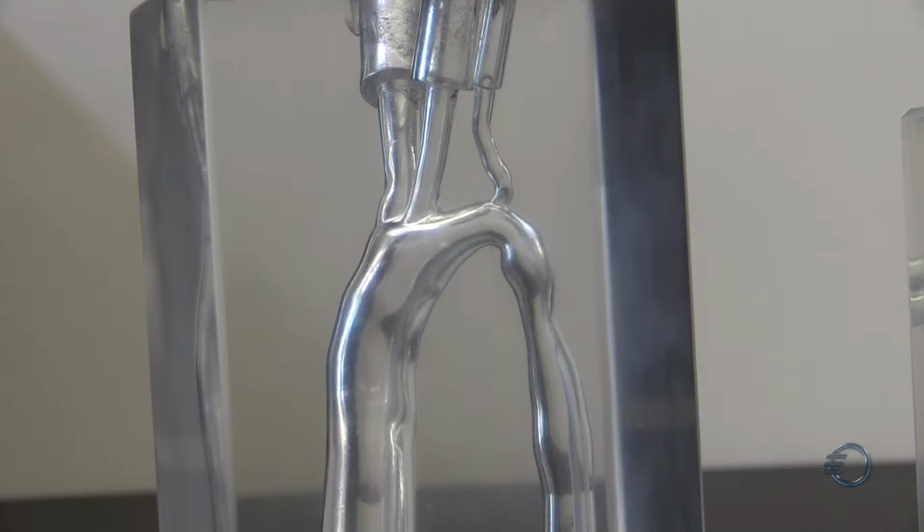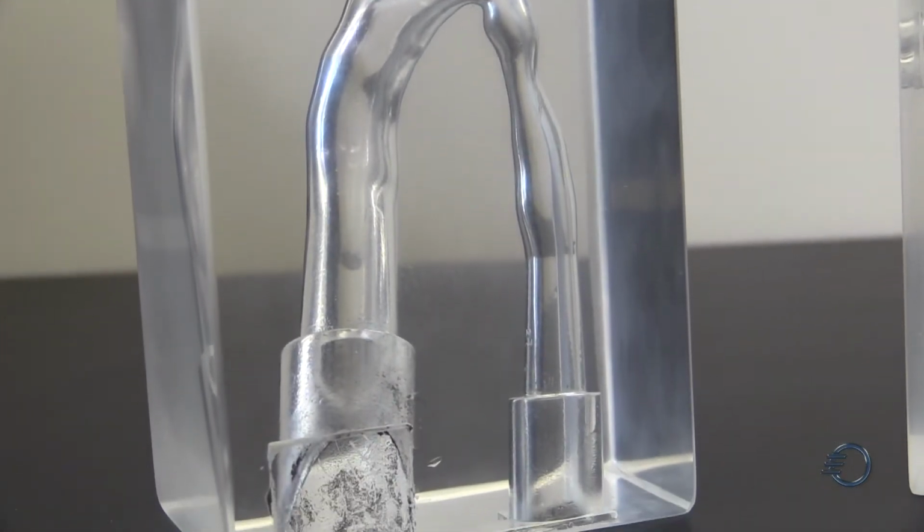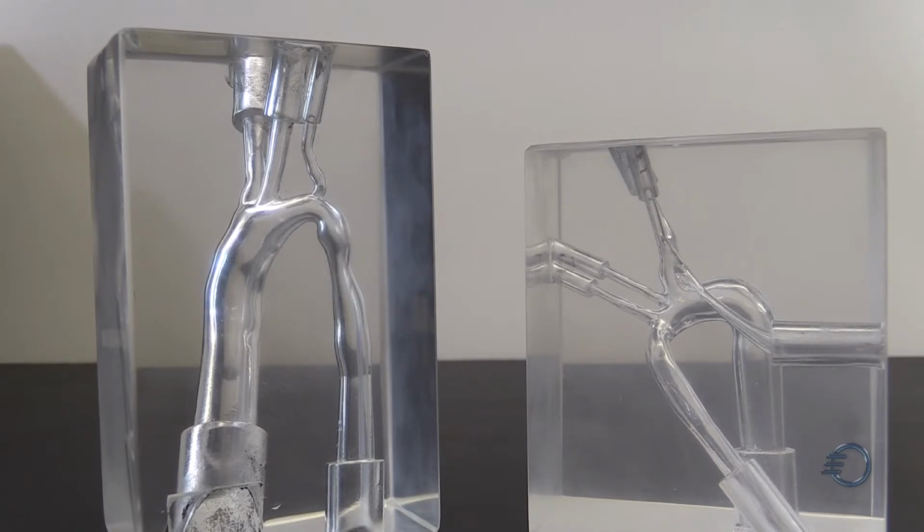We take patient data, 3D print it with Solidscape product, and then we are able to do experimentation to allow us to better understand how our anatomical systems actually change the flow patterns, and more so, how we can best treat patients with the same type of anatomy.